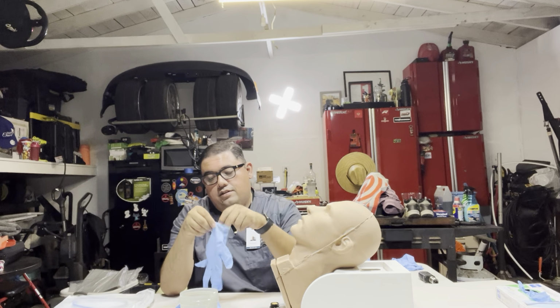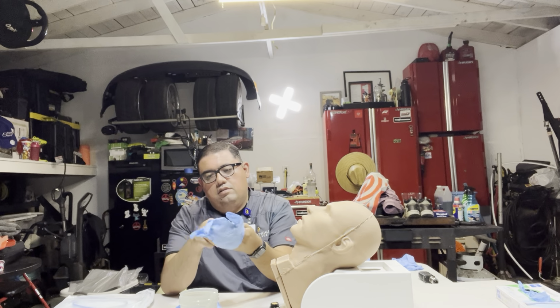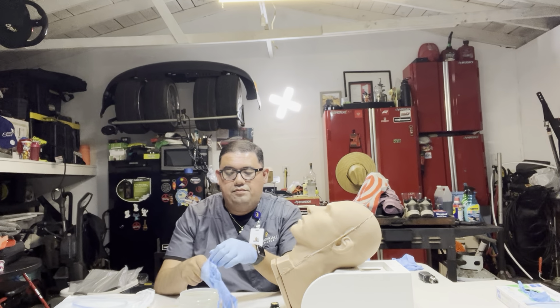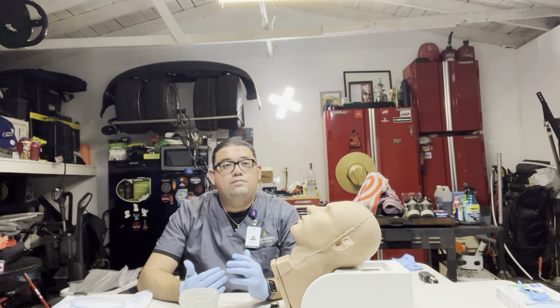Next, I want to go ahead and perform hand hygiene, apply my gloves, and introduce myself to my patient.